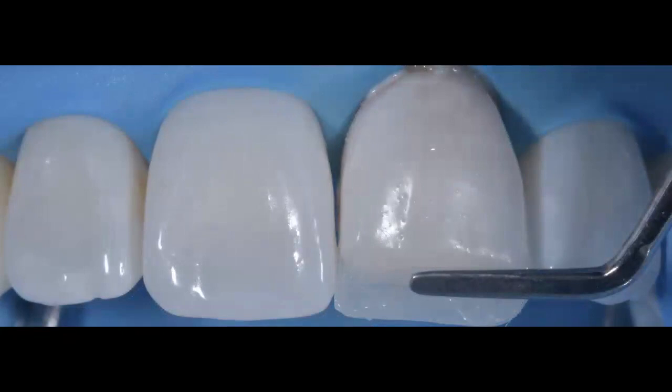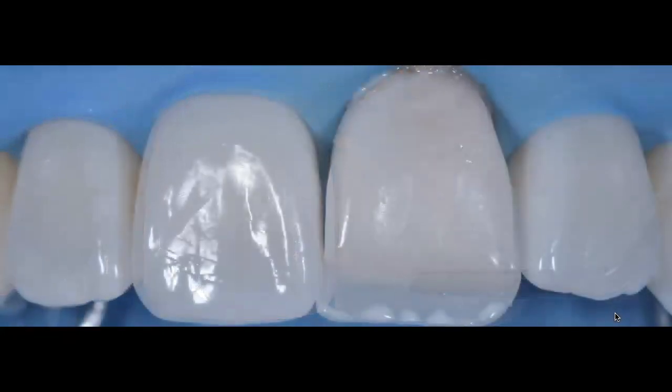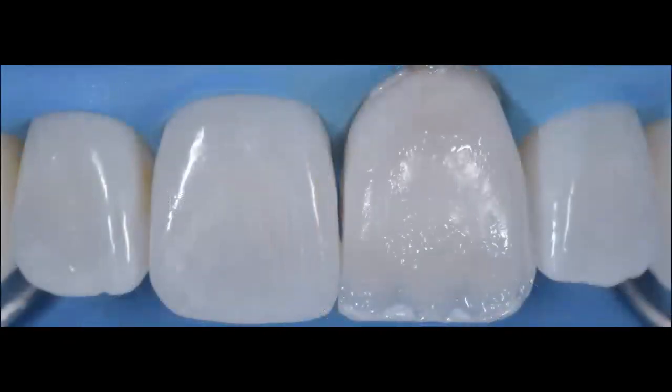And with that opaque bleach shade, I'm going to start repairing that fracture area first. That's the first area. I don't want to have any voids there. So I always like to add a little bit of composite there before I start building up my mamelons. Here I'm adding a little bit of that same flowable opaque that I use on the cervical third. I'm adding it in the incisal third so that I can recreate that halo that I showed you in that cross-polarized photo that I showed you initially, when we were evaluating the aesthetic aspect of this tooth.